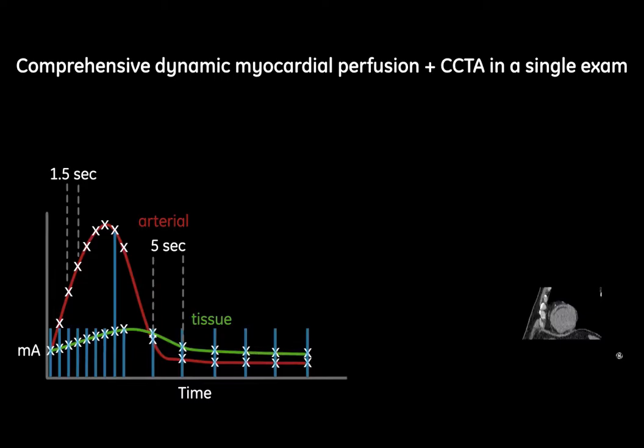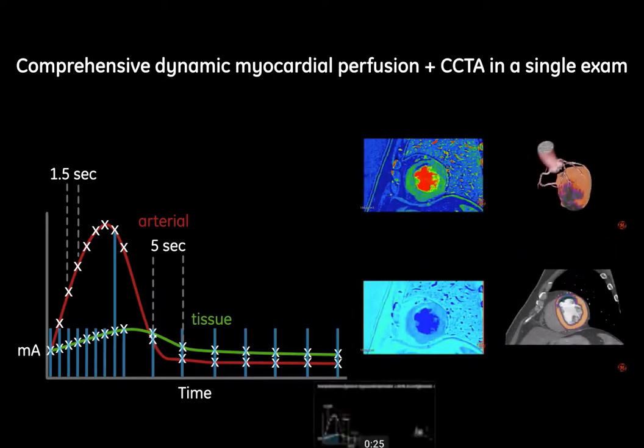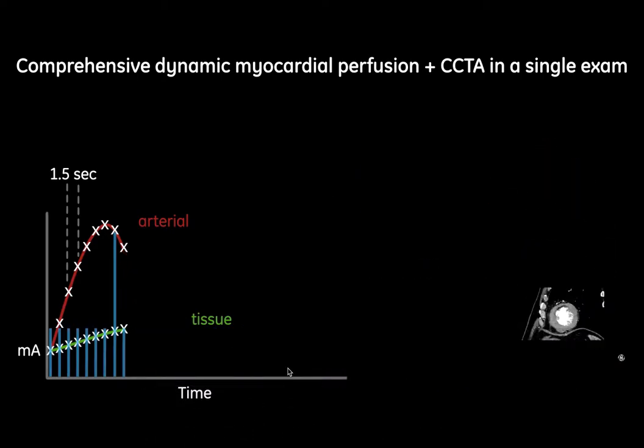I think you want to see the picture on the bottom right. Here, the blood is already washed out, and it's homogeneously gray. If I go back, you can see there's an area that is still dark, whereas the rest of the heart is much brighter, meaning that area is not receiving any of the iodine that would make the signal go up.